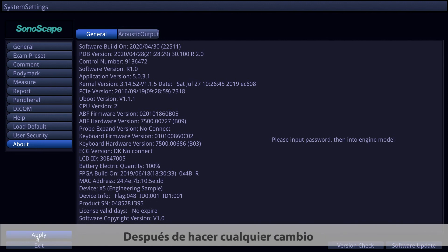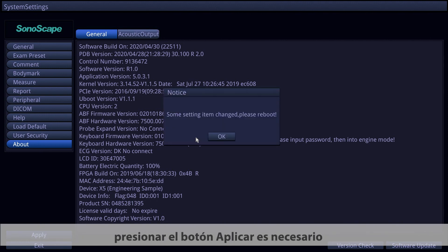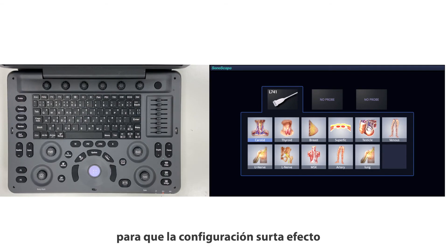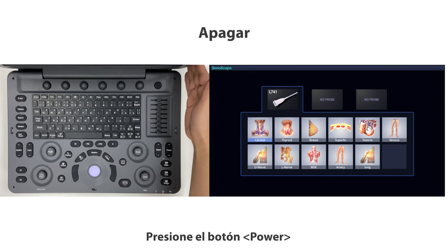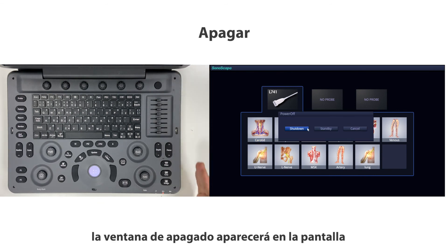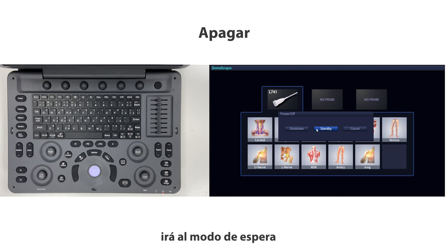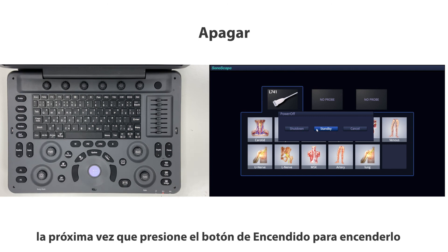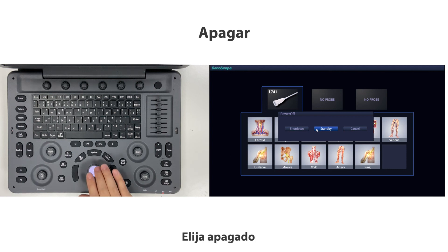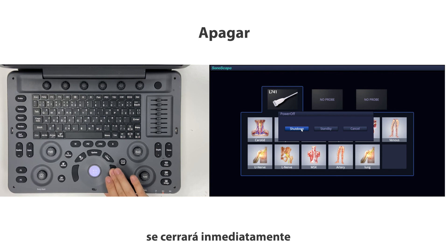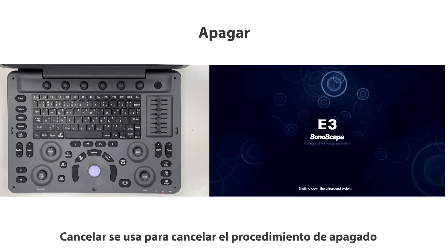After making any changes, press the Apply button to make the settings take effect. To power off, press the power button — the shutdown window will appear. Choose Standby to enter standby mode, which will boot up in several seconds next time you press the power button. Choose Shutdown to shut the system down immediately. Cancel is used to cancel the shutdown procedure.